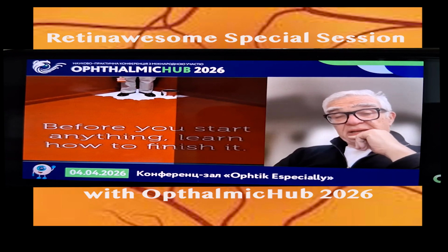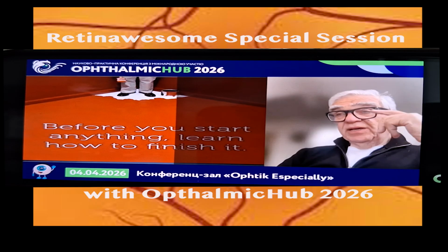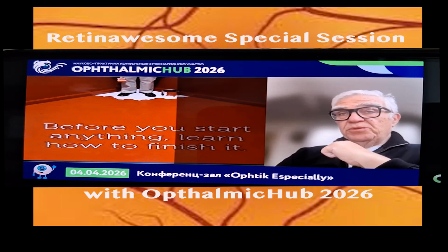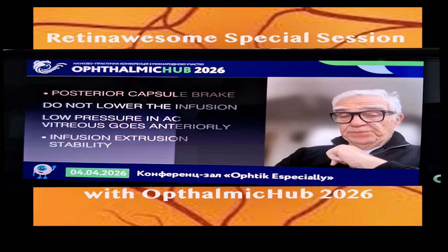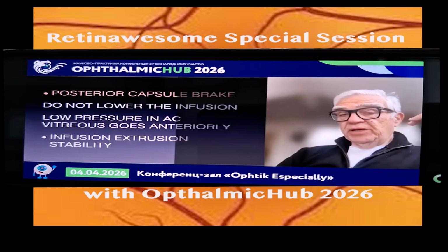So we always say in my country, before you start anything, learn how to finish it. And this is very important when you start something, to learn what is expected from you. Let's start with a posterior capsular break. Let's take it step by step.